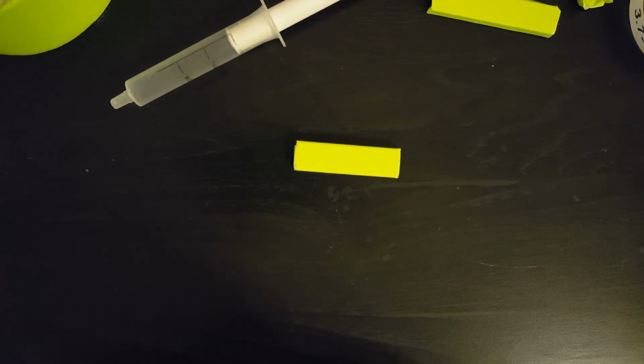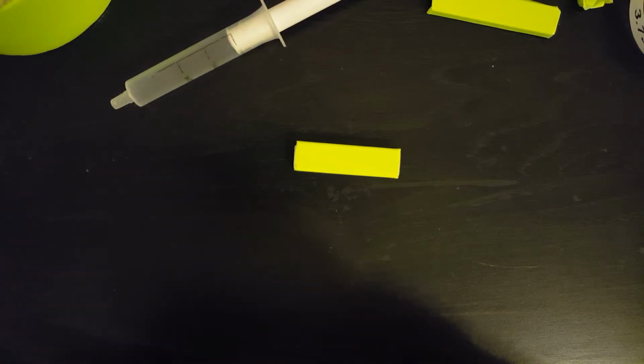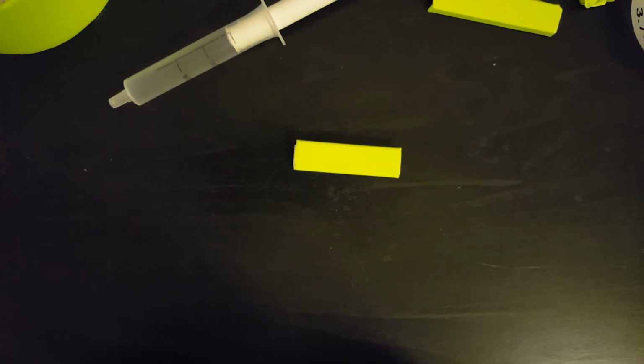But this is a question that comes up a lot with clients: how do I give my children medication? It's hard to do a teaspoon of this and a tablespoon of that, and here's the deal with syringes and using this method. People think, well, what about when my child gets older? Well, why can't you use a syringe with the older child? There's nothing wrong with that. They say, if you read around, it's more accurate anyway.